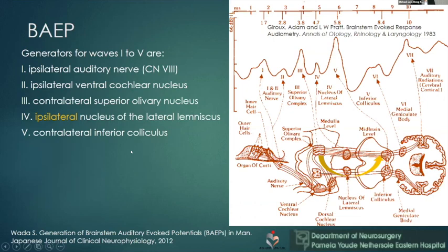And for the hearing, we have the BAEP, the brainstem auditory evoked potential. I think this is a genius diagram. Looking at the date of publication, this paper is from 1983. You know that we didn't have computers in that 1983, okay? So these are all hand drawings, but quite accurate, actually.